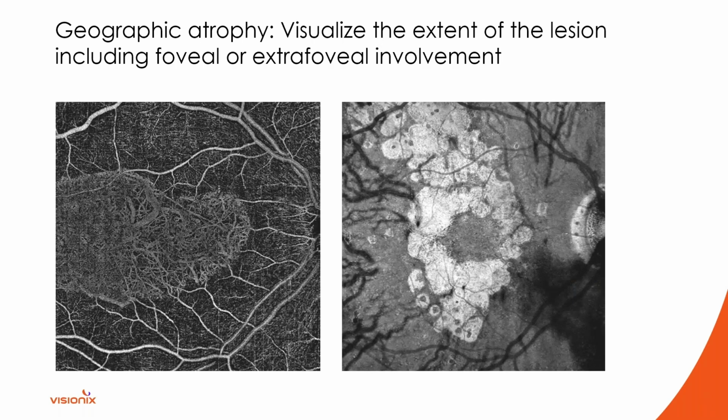and you can see how these images are doing over time. Geographic atrophy has been a huge topic of conversation over the last year or so, and OCT-Angiography is gaining ground in helping us determine what's happening at the level of the choriocapillaris and what the potential for progression is in patients. So you can see here that if you have a wider field OCT-Angiography image, then you can visualize the full extent of the lesion. Whereas in the good old-fashioned days of OCT-A, I would argue that this little box in the middle was what we were seeing, and we'd be missing the full extent of the lesion.